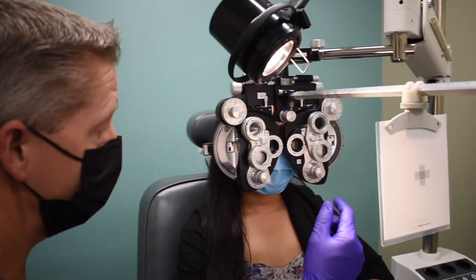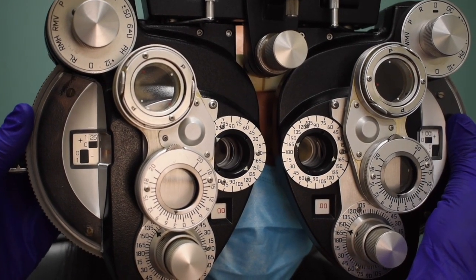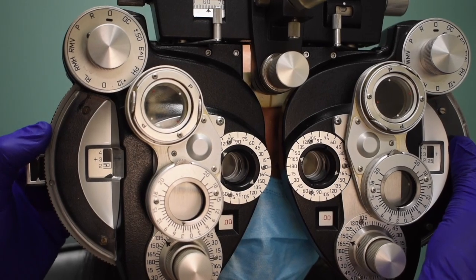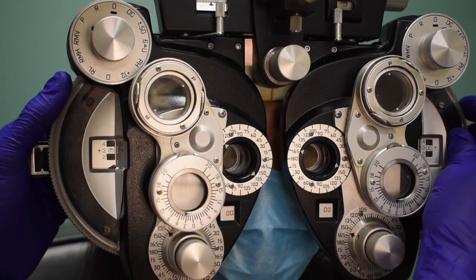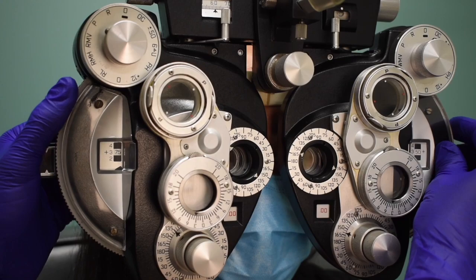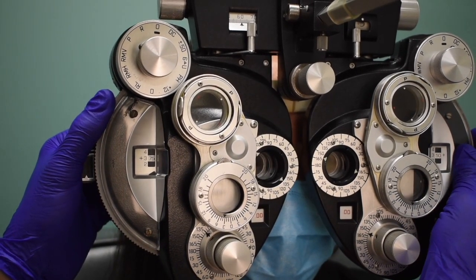With the patient looking at the card, instruct them to tell you when the letters get so blurry they can't read any of them at all. We're doing the negative relative accommodation, being very careful to change both eyes at the same rate and at the same time. We pause partway through to check — once the patient confirms they can't make them out, we go two past, then bring them back to recovery. Here we have a blur out of plus 3.75.